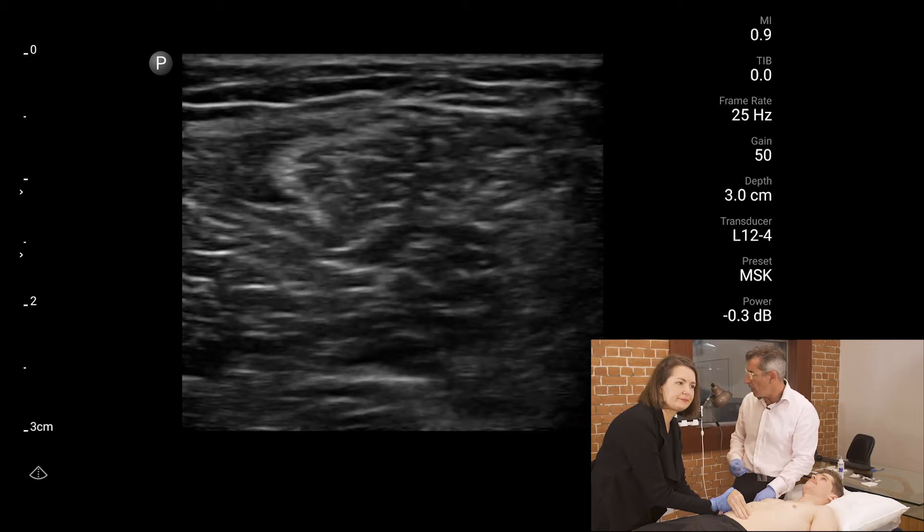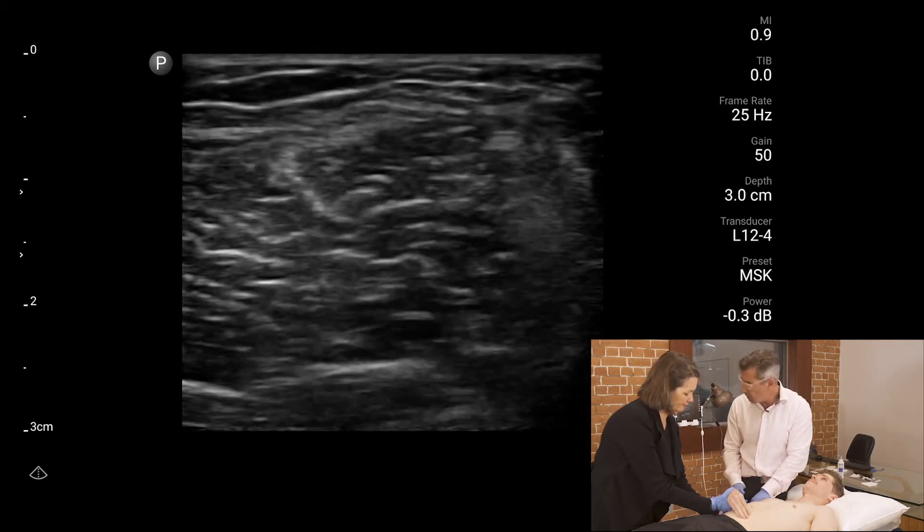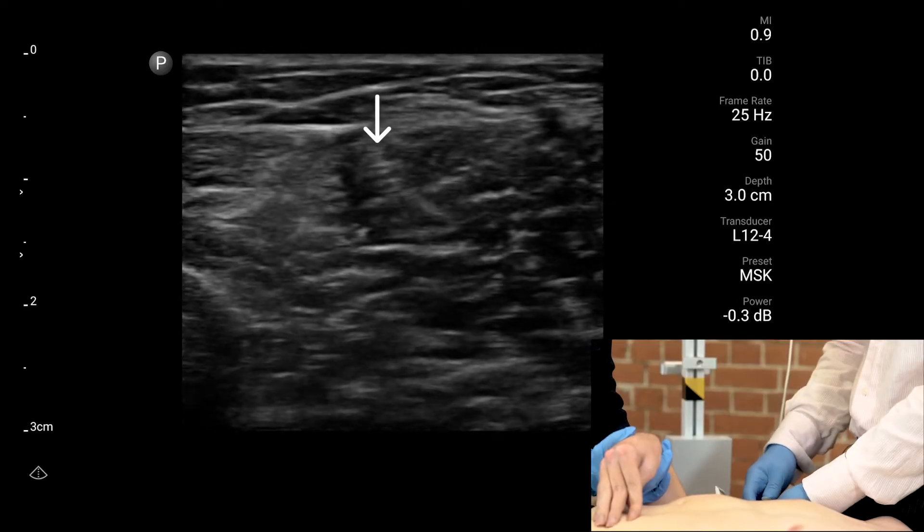The large muscle in the centre of the screen — a two centimetre depth will be fine. Scratch now. There it is.